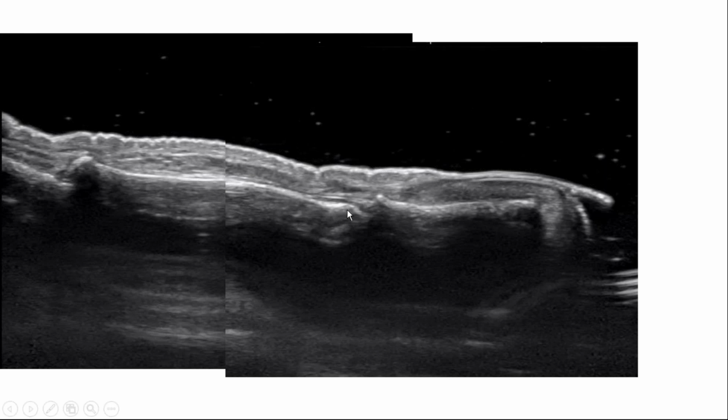But water immersion is actually great, because you can see it much clearer here, because your focal point is exactly at this level, and the nail is not as hyperechoic. If you remember when you did dorsal wrist digit imaging, the nail looks almost the same as bone, right? You have a hyperechoic bone here.